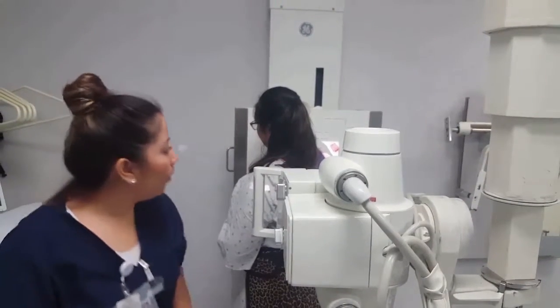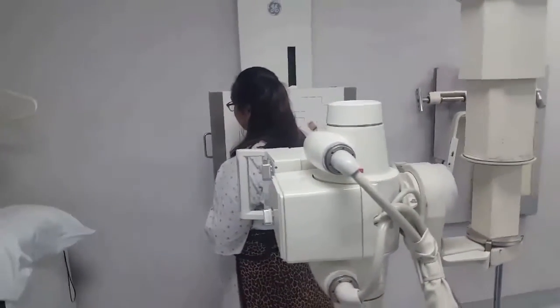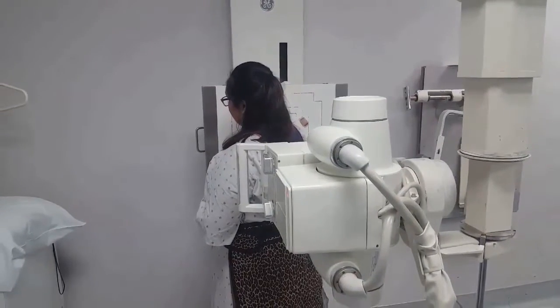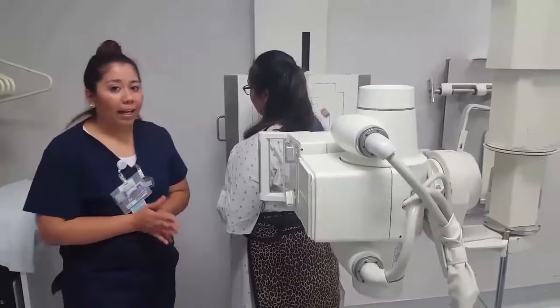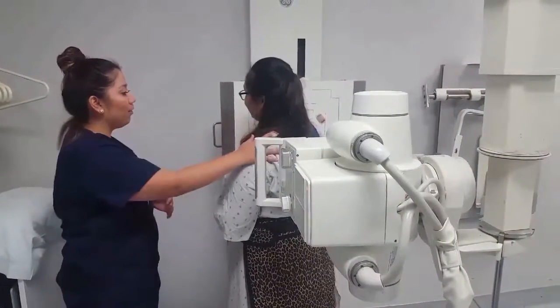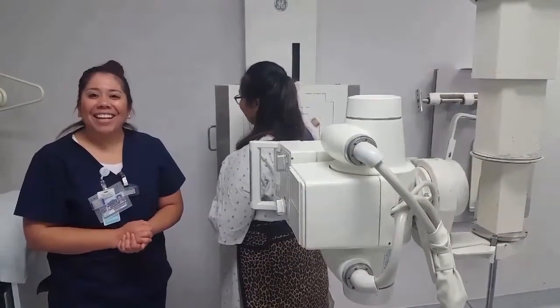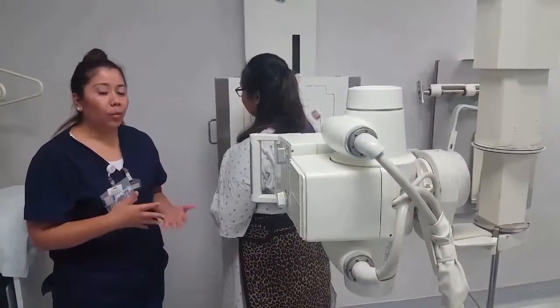Okay, so once we have that ready to go, ma'am, if you could follow my breathing instruction, take a deep breath in and hold it. Beep, X-ray. And our technique for this was 85 kVp at 18 mAs. And you could breathe. I'm sorry for having you hold it longer than you should. And technique is 85 kVp at 18 mAs. So after this is done, we will proceed.